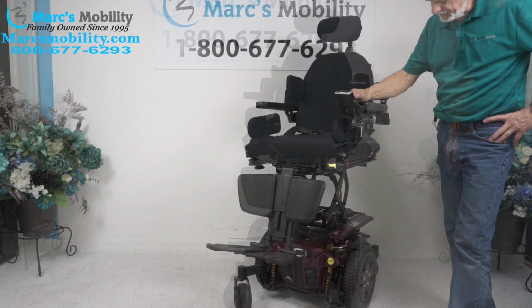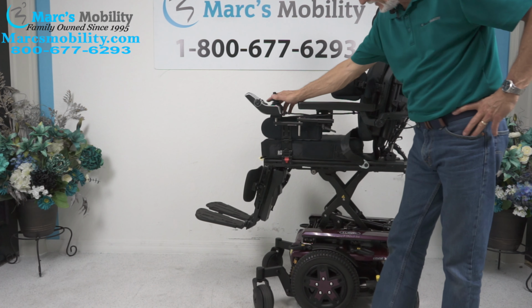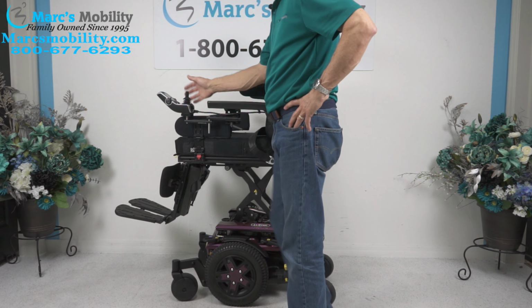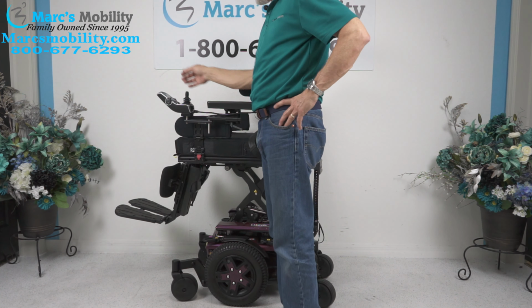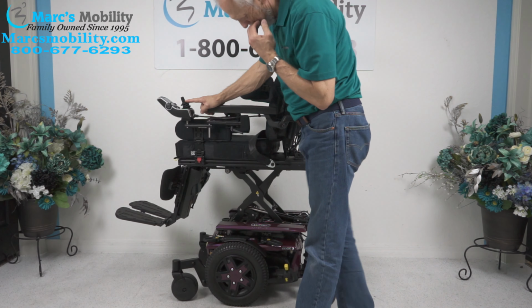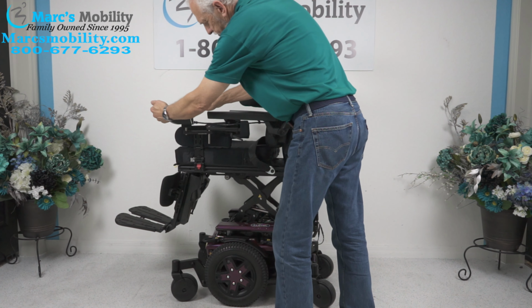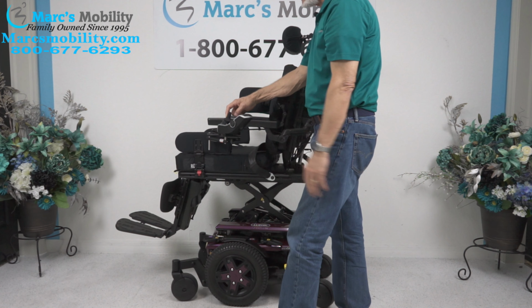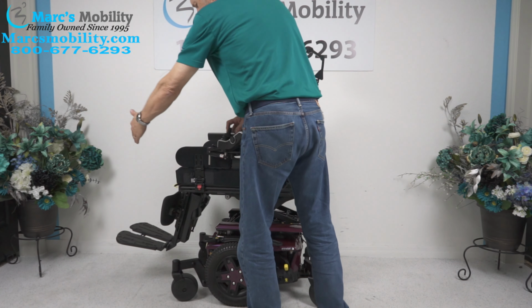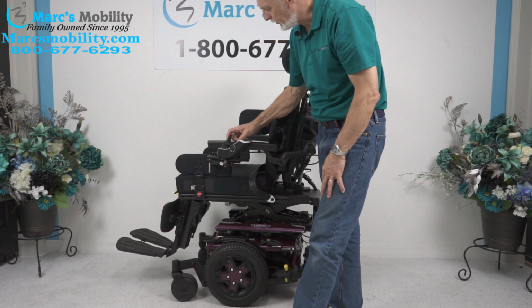All right, so now we've covered the seat lift and the suspension. The next thing I'm going to do is bring the seat back down. I'm going to put it back in the seat function. We're going to bring the seat back down. As the seat is going down, let's talk about the swing away joystick. This is called a swing away joystick. So you can swing the joystick from the front to the side. That gives you an extra 6-7 inches to get to a dining table.